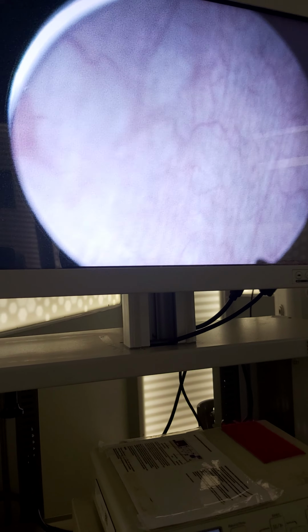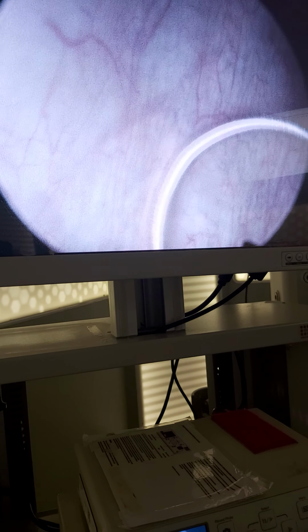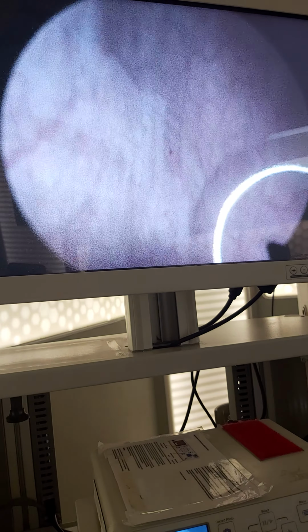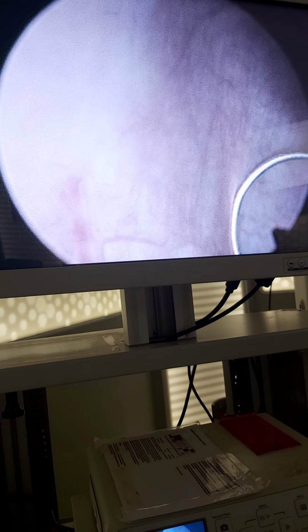A membrane is formed over the tissues. I can scrape them. So these are very sensitive to urine touch. This is a dirty tissues. So the next step is interstitial cystitis-like syndromes. So these membranes always cause too much irritation and inflammation. Look, when I scrape these tissues, this is whitish, this is more yellowish. Here this is better, but here these parts, they become infected.